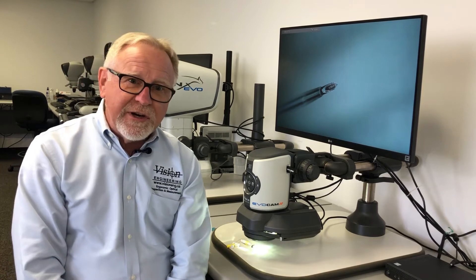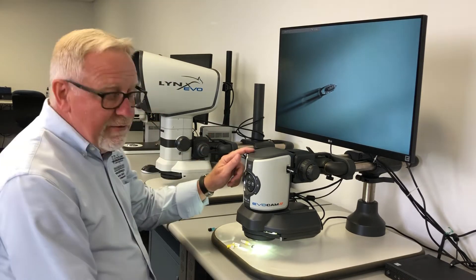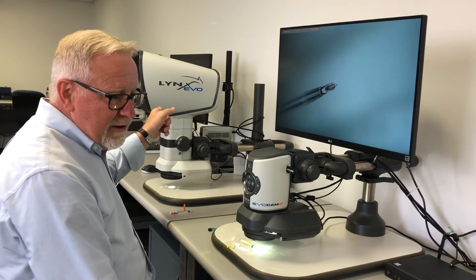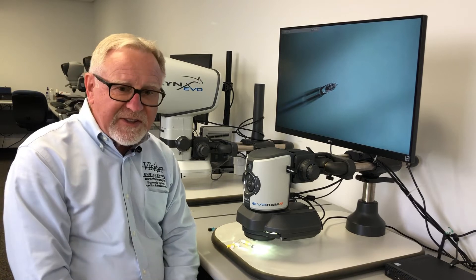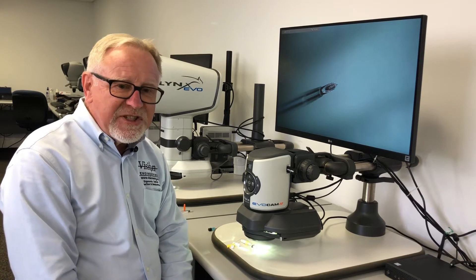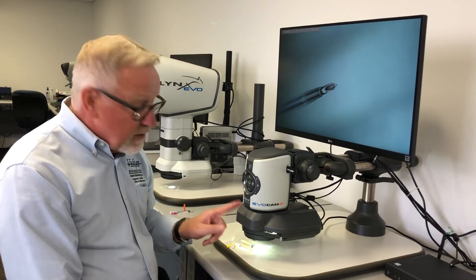Hi, I'm Gary Ellum with Vision Engineering. In previous videos we highlighted both the EvoCam 2 and our Lynx Evo stereo system. Today we're going to talk about a specific application: the inspection of hypodermic needles using the oblique viewer.